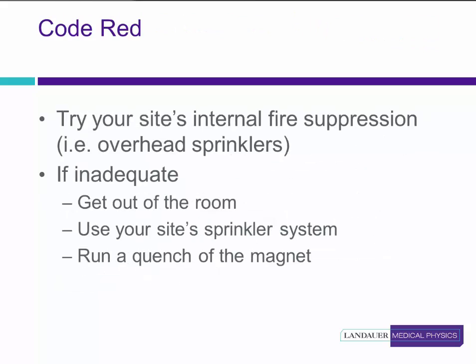In the event of a fire, the MRI system isn't immune. The first concern always is making sure that the patient is out of the room during this type of event. Most likely the sprinkler system will engage and douse any flames. However, if this doesn't work or is inadequate, we have another option known as an MRI quench. With an MRI quench, it's recommended that you talk to your facility's technologist to ensure that a policy is in place. If assistance is needed, please consult with your local medical physicist.